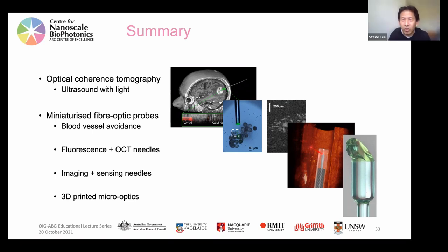The first is, you talk a lot about this intricacy in 3D printing. Can I ask, what is the intricacy? Is that the chemistry involved in understanding polymerization, or the optics when you want to print a massive complicated structure? Both of them impact what you can do, and both of them can result in artifacts in your imaging. The chemistry will really impact the resolution you can print to.